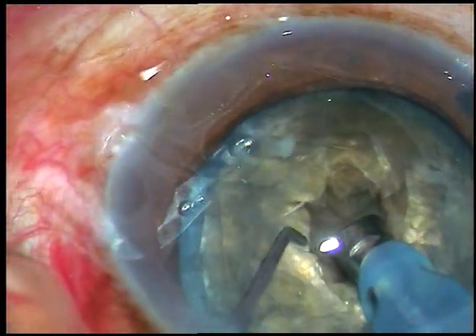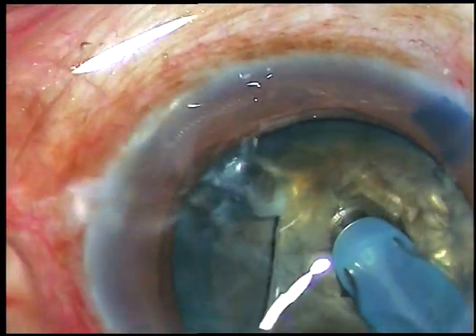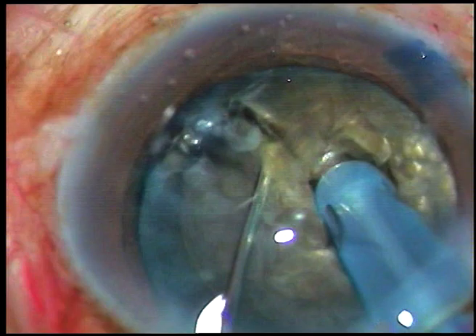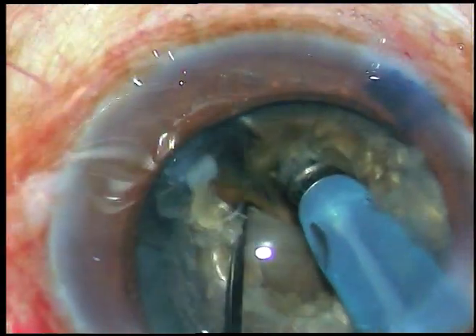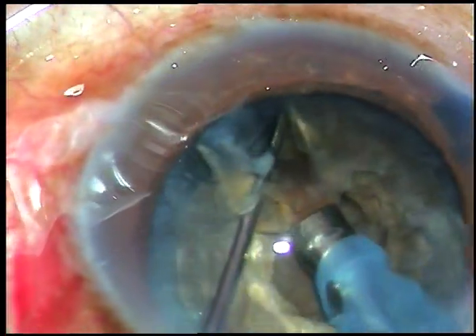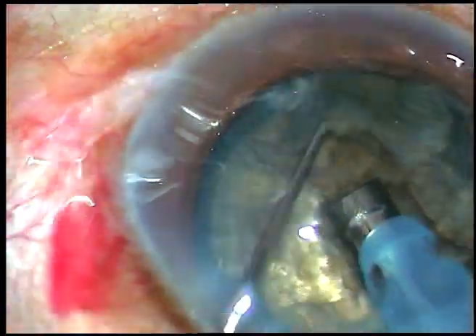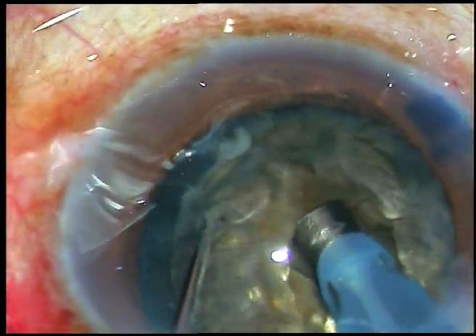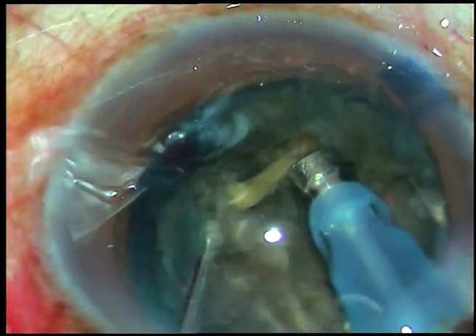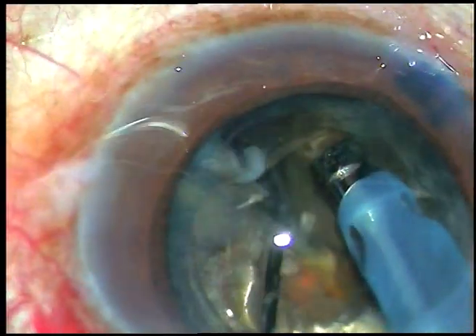Now I go into the substance of the nucleus. I am in Phaco 2 mode with high vacuum — vacuum is 450 mmHg. I have cracked the nucleus. Now, along this crack, I want to divide the nucleus into two halves. I rotate it 180 degrees and then along the first crack, I separate the nucleus into two halves.